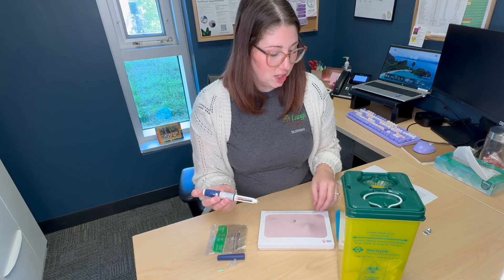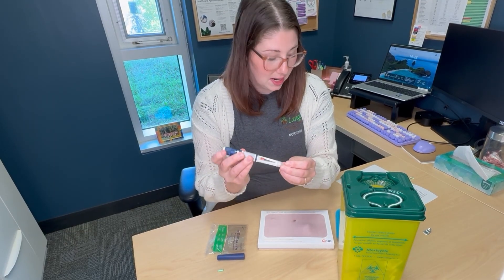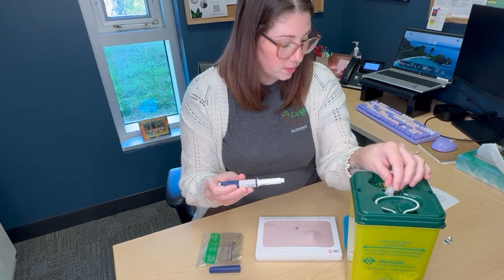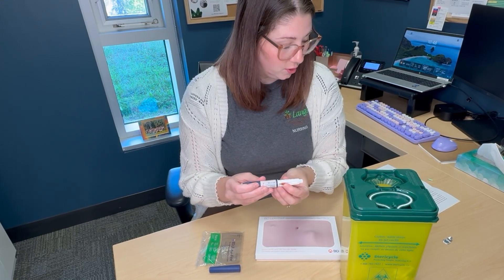After completing the injection, you can reattach the clear needle tip tightly, then twist the used needle off and dispose into your sharps container, which will also be provided from the pharmacy when you pick up your prescriptions.